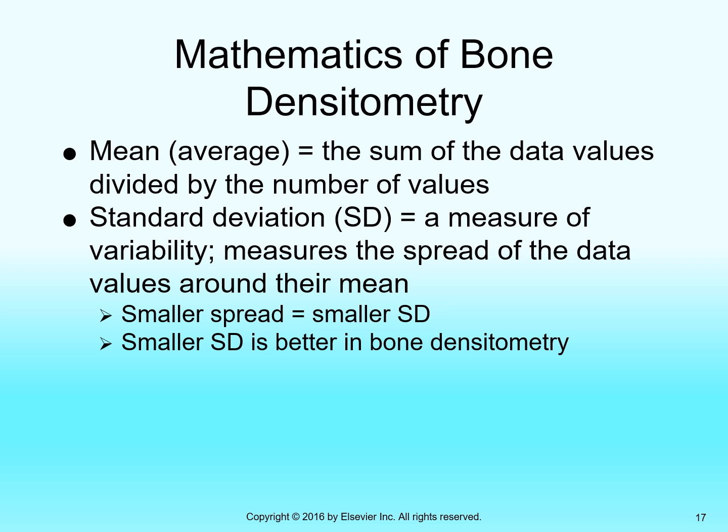All right, so let's say in the course of a single exam, you take 5 measurements because that's the facility protocol. Instead of just a single measurement, you take 5 measurements and you average those measurements. That number, if the machine is running right, should be more accurate than any of the individual measurements.